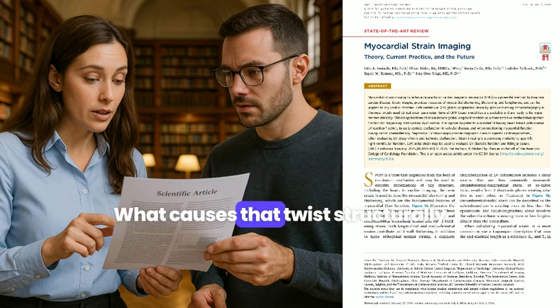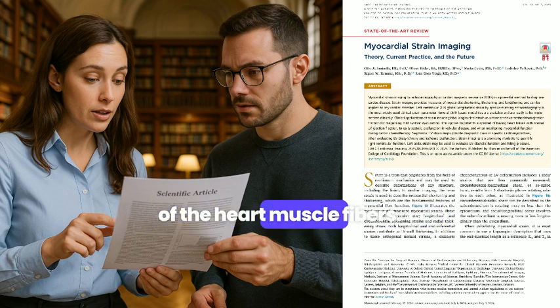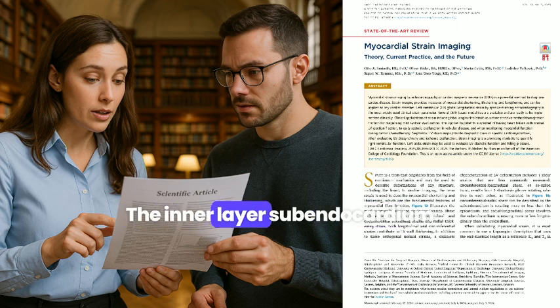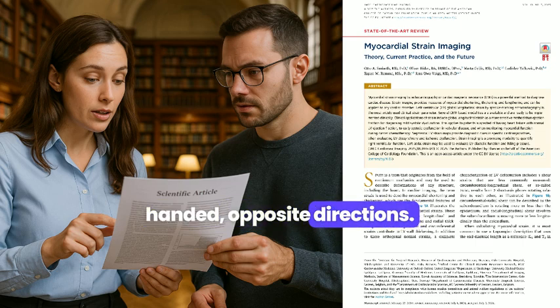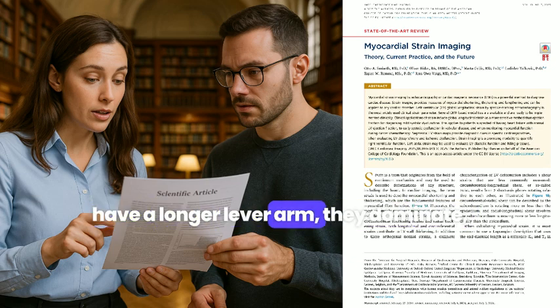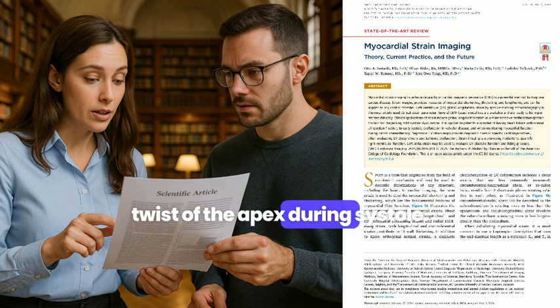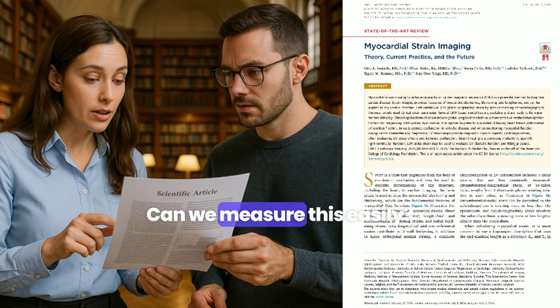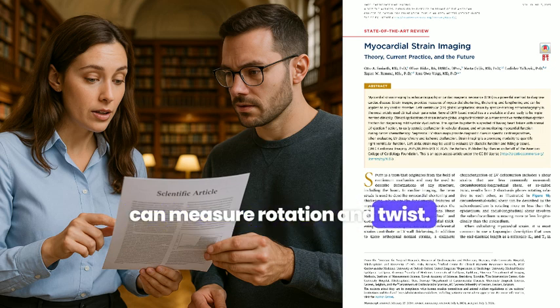What causes that twist structurally? It's the amazing spiral architecture of the heart muscle fibers. The inner layer, subendocardium, spirals one way, a right-handed helix. The outer layer, subepicardium, spirals the other way, left-handed. Opposite directions. Yep. And because the outer subepicardial fibers have a longer lever arm, they dominate, causing that counterclockwise twist of the apex during systole. Fascinating. Can we measure this easily? Both CMR and STE can measure rotation and twist.